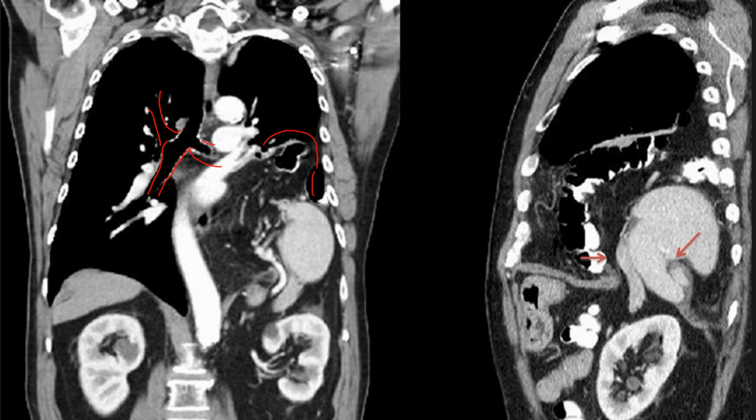Yes, I know this is not switched, unfortunately. And here's the descending aorta. Here's the kidneys down here. Hopefully you guys start to see this in here. You can even see the spine down here as well too. So over here would be the sternum, this direction, and back here you can even see the scapula, and then the spine would be back here.